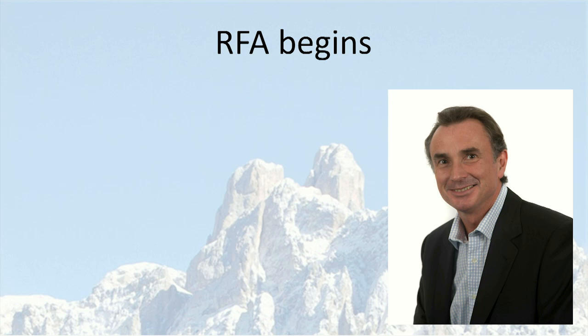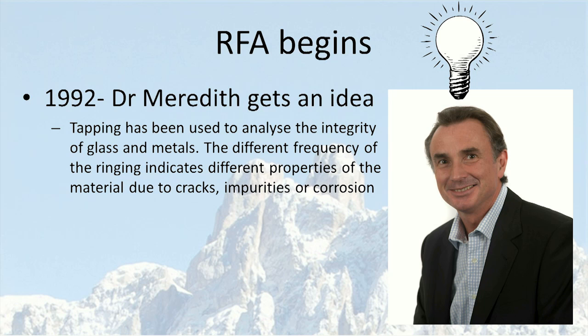So it all started with this guy, a good friend of mine, Neil Meredith, who in 1992 got an idea. At that time he was at the Eastman Dental Institute in London. And the idea he got was from another part of industry. Historically, tapping has been used to analyze the integrity of glass and metals. By tapping on the glass, you will have a ringing sound. And the different frequency of that ringing sound indicates different properties of the material due to cracks, impurities, and corrosion. So for instance, the integrity of train wheels is tested in this way.